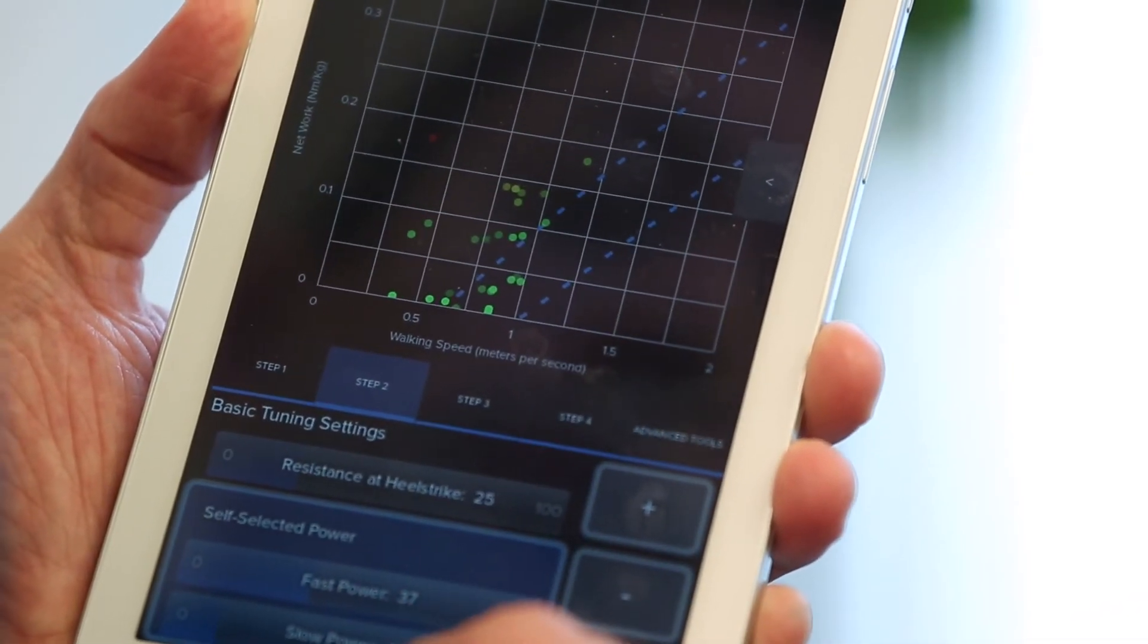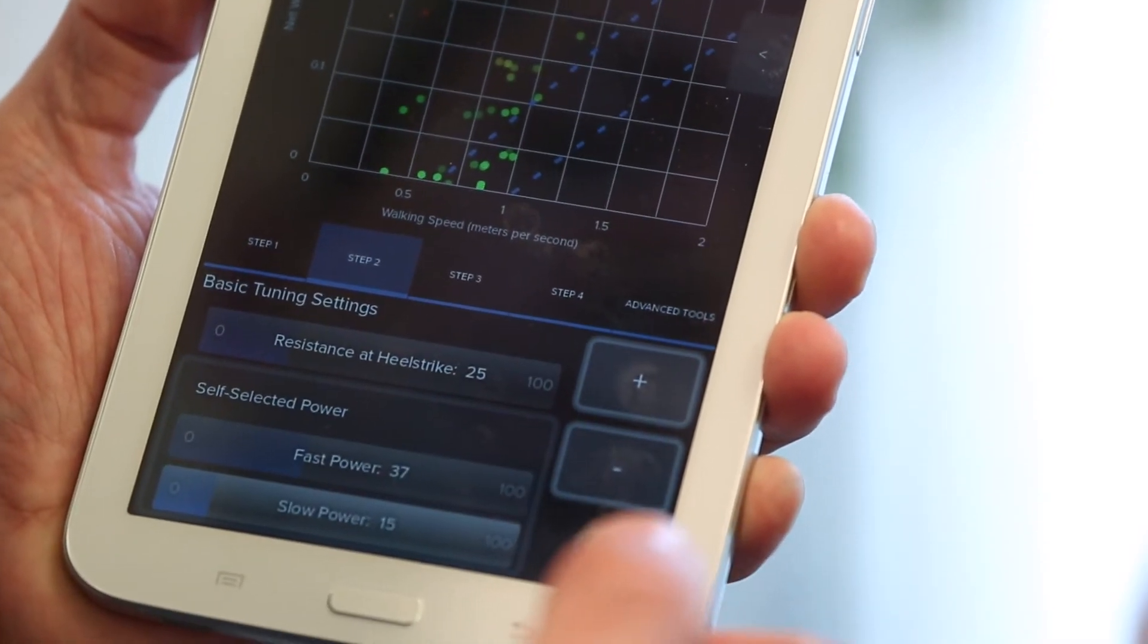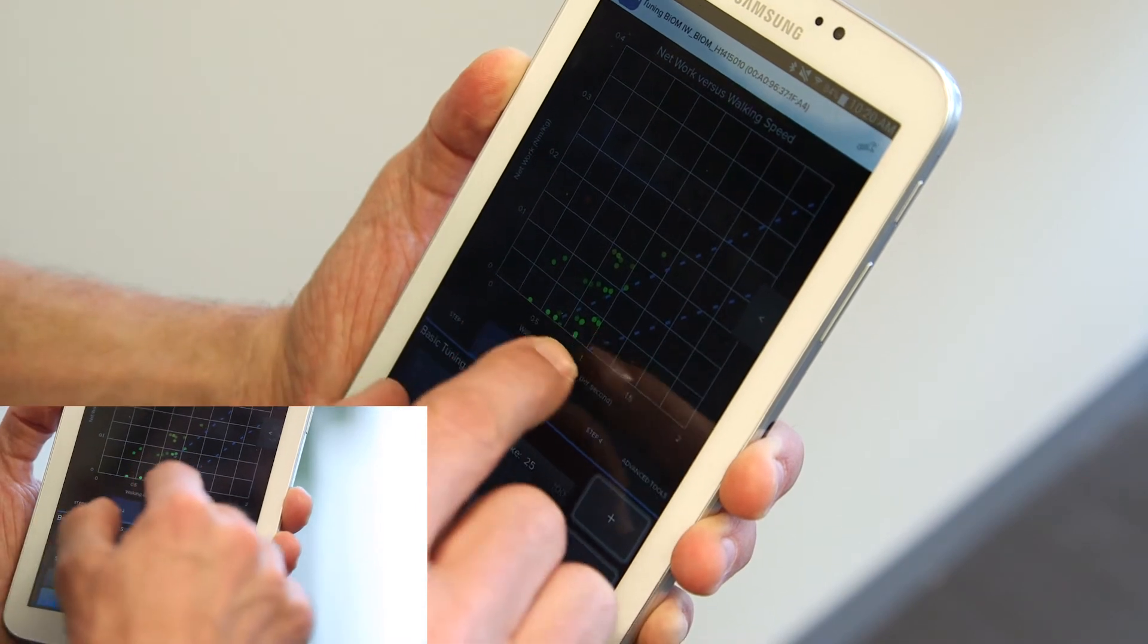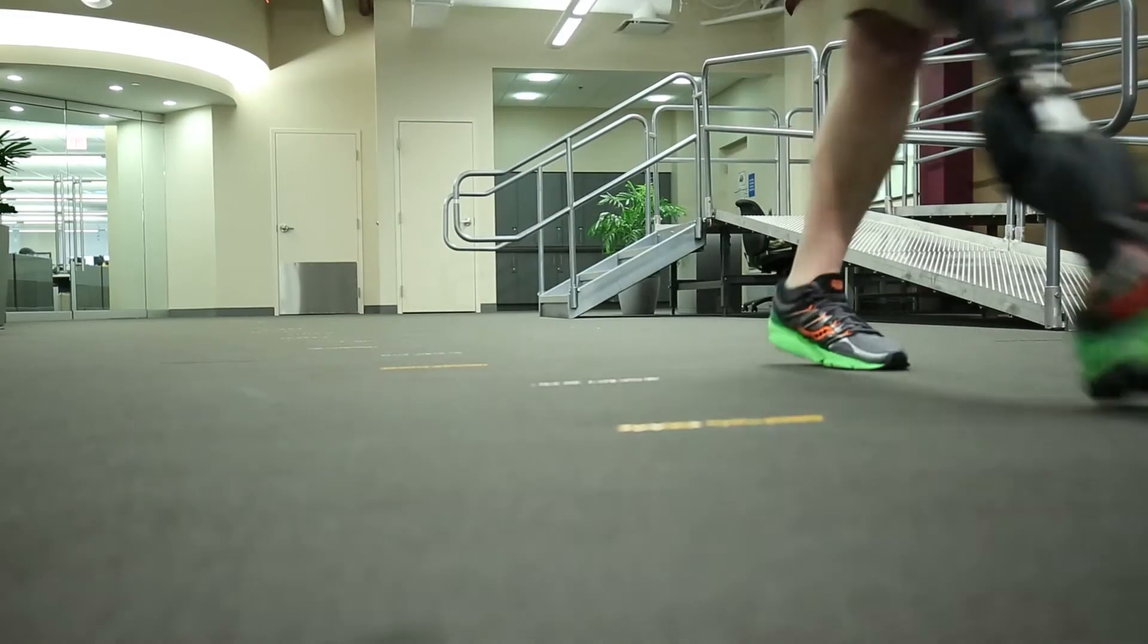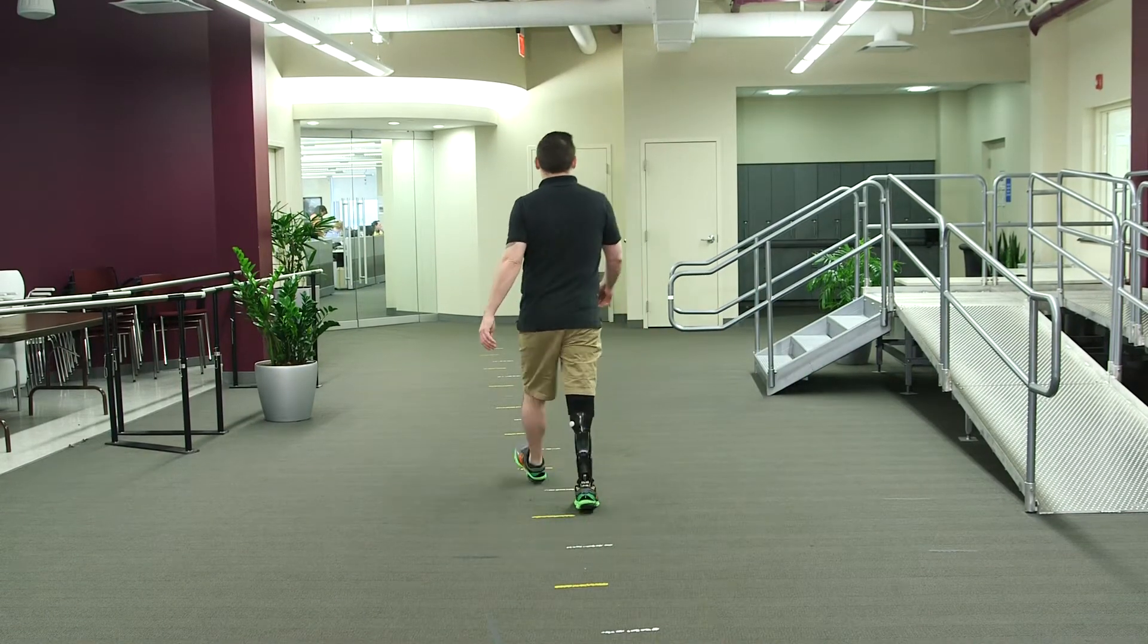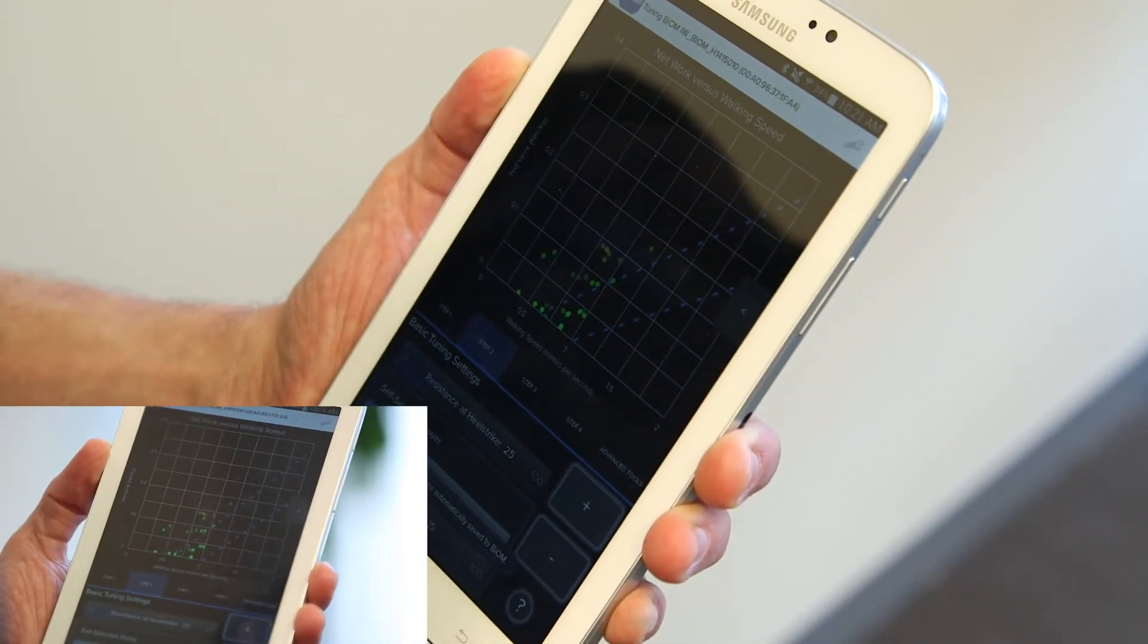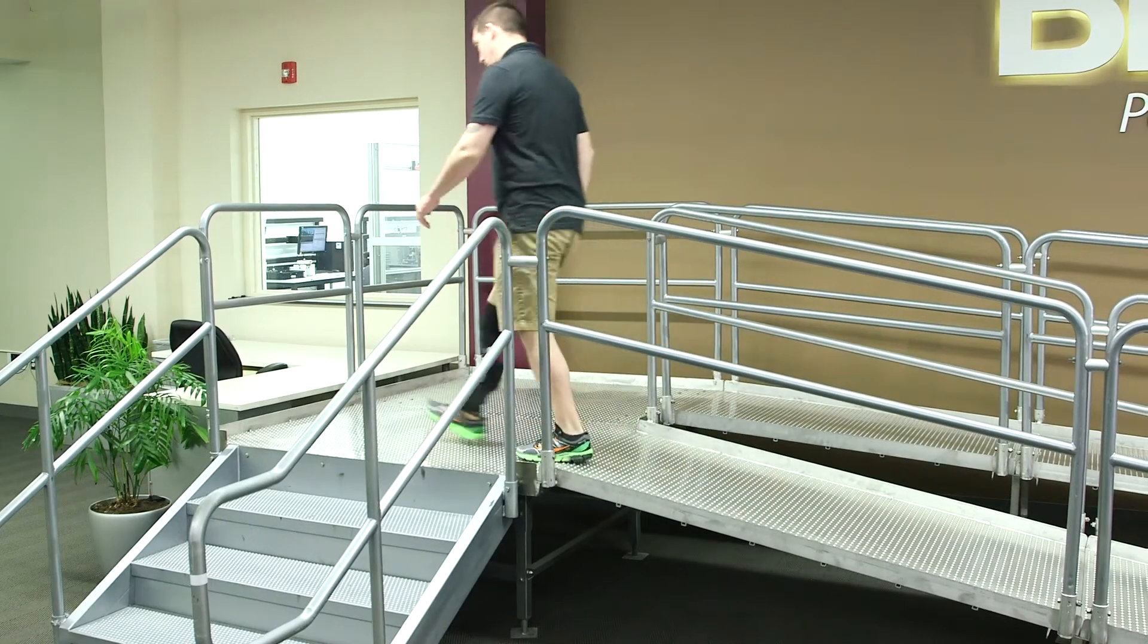Just as you would imagine, the setting for slow power should always be less than the setting for fast power. In order to determine what the settings for each one of these parameters should be, we would first select slow power, have the patient walk at a pace that's slower than their self-selected walking cadence. We should see dots come up on the lower end of the walking speed here. Then we can do the same thing for fast power, have the patient walk at a pace that's faster than their normal walking speed. At that point, we'll see dots occur in the upper right-hand corner of the graph to represent the faster walking speeds. You do also want to confirm a pace that's at their normal walking speed as well. Ultimately, we'll have a plot of three different walking speeds. If the patient is walking consistent, we should see these nice clusters between each one of those speeds. At that point, what we'll want to do is verify that the patient feels like the power is natural and normal as compared to their sound side. Once we confirm that, then we can move to having the patient walk on different types of terrain.